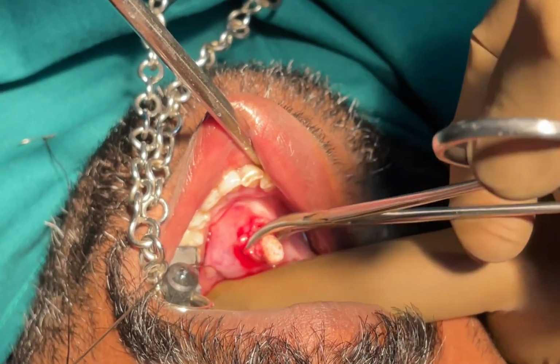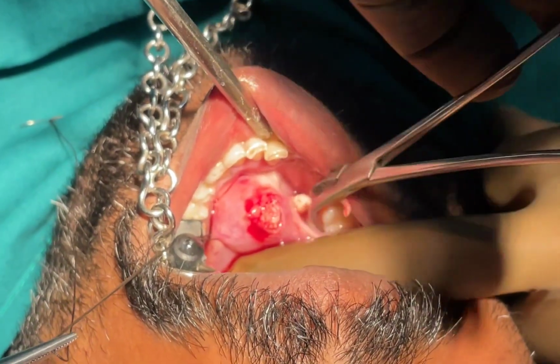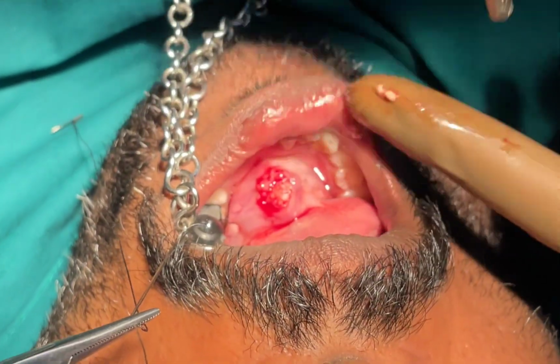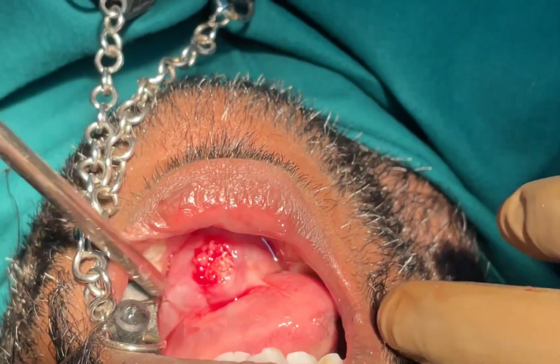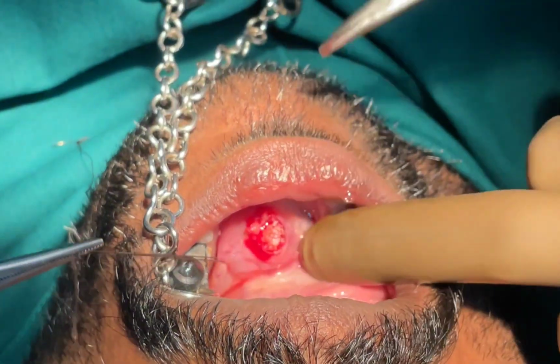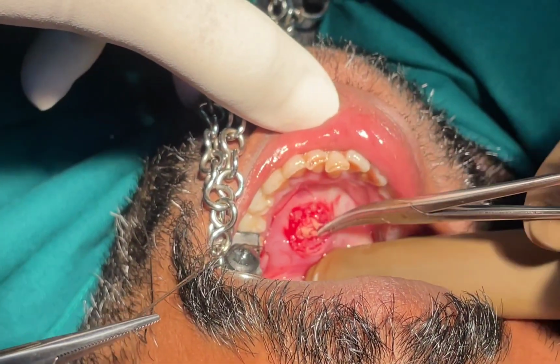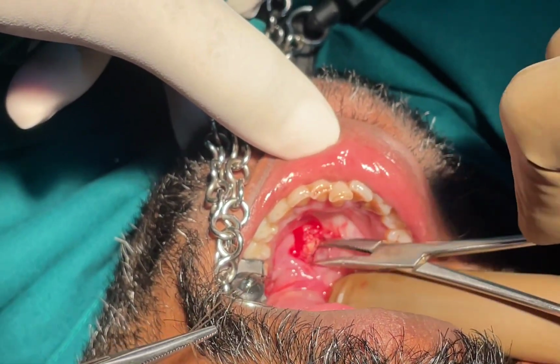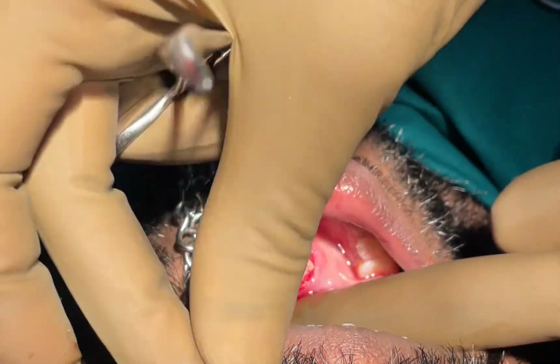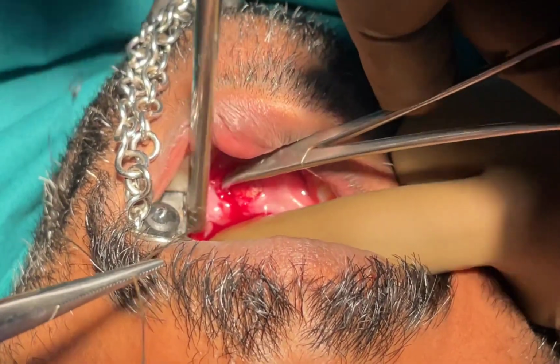So never try to crush or hold the stone firmly. If you try to do it, the stone will crumble, because it's only salts which are multiple concretions which form a stone. So never try to hold the tip of the stone, because that's going to be a weaker point and it will start crumbling and coming out piecemeal. So start dissecting bluntly again without injuring the vital structures in the floor of the mouth.